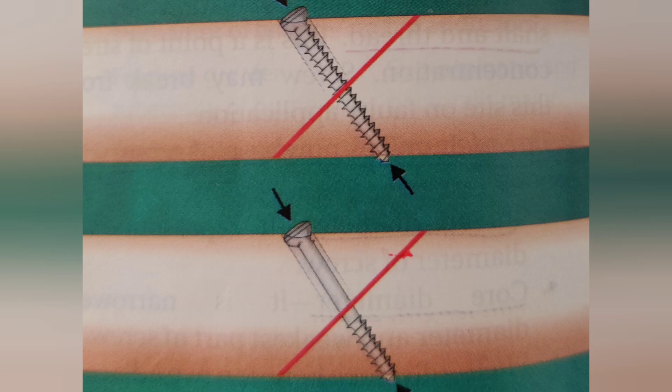Lag screw: its threads take part into the far cortex and it will provide interfragmentary compression along the fracture site.